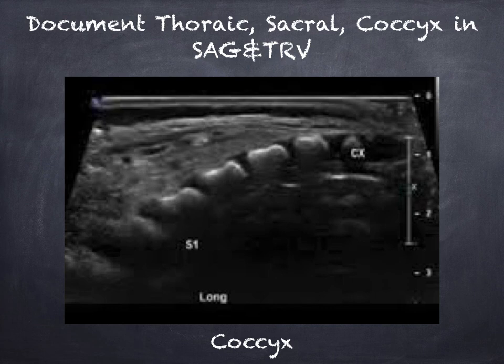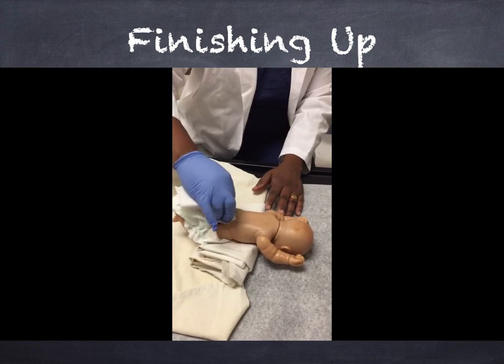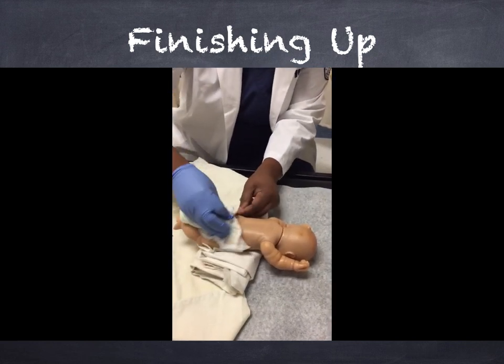Now that you've documented all those structures, finish up by documenting the thoracic, sacral, and coccyx in sagittal and transverse views. The coccyx is a small body inferior to the last sacral vertebrae at S5. It's mostly cartilage in neonates, so it may appear more hypoechoic than the rest of the spine. When you're finished, wipe off the infant with a soft cloth, put the diaper back on, and bundle the baby back up the way you found them.